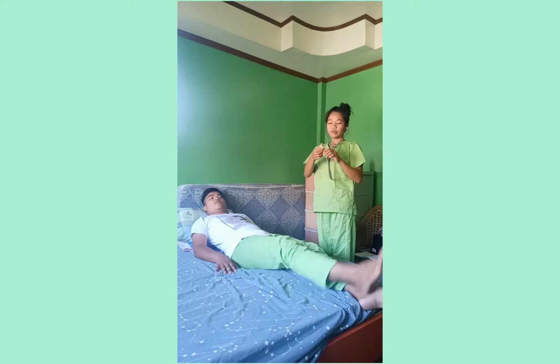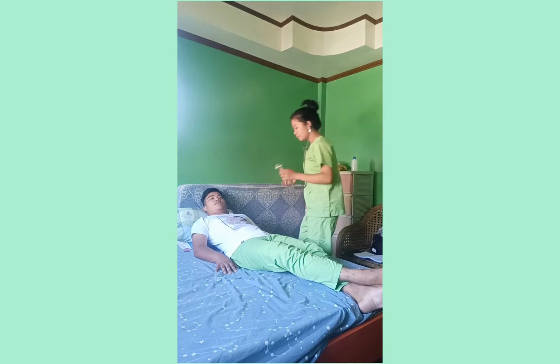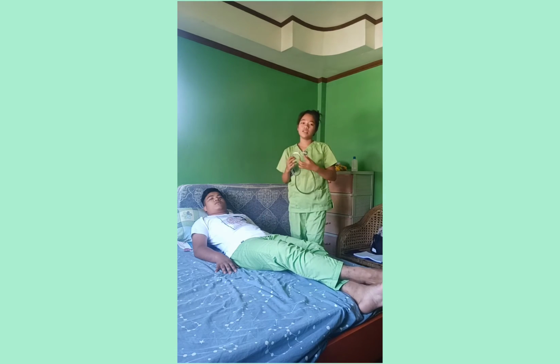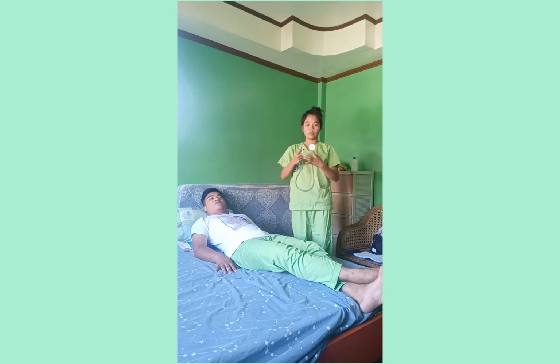Okay, first I am going to use the diaphragm of the stethoscope. Okay, next I'm going to use the bell of the stethoscope to hear the low pitch sound.